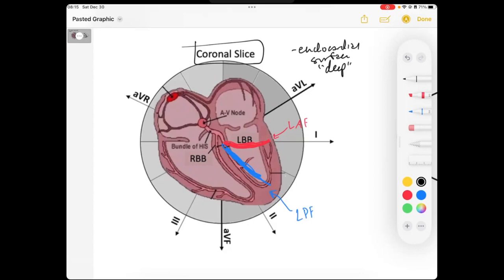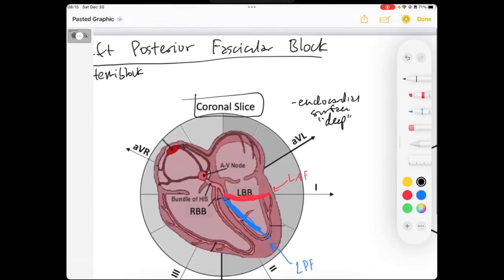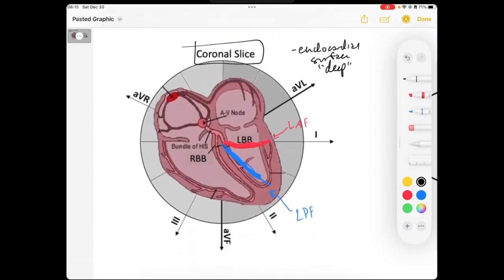And so today, when we go over the left posterior fascicle block, we're going to be talking about when this posterior fascicle is damaged or blocked, what is the morphology of the QRS going to look like? Because this is going to be depolarization of the ventricles.